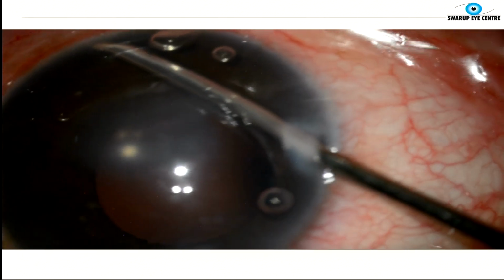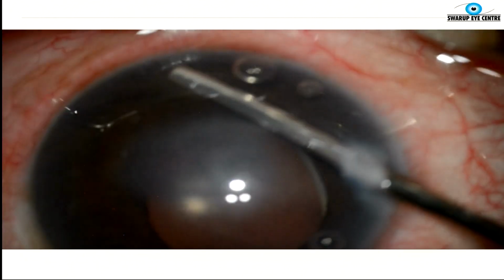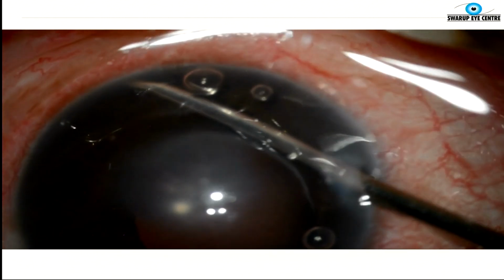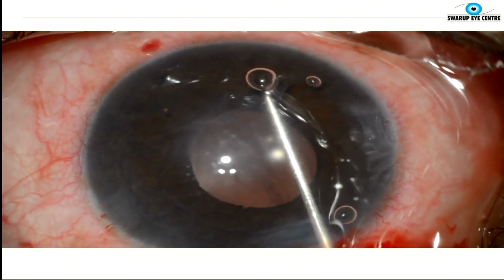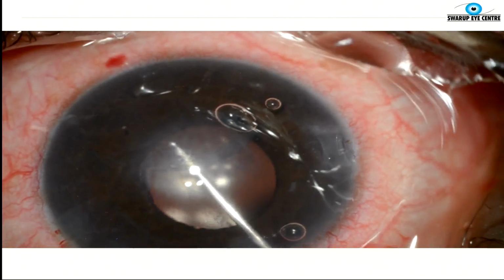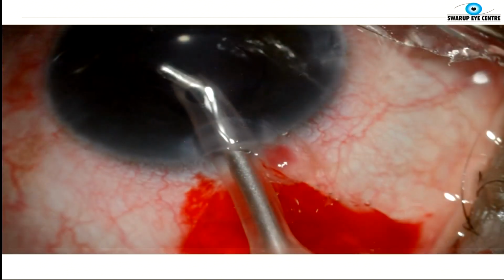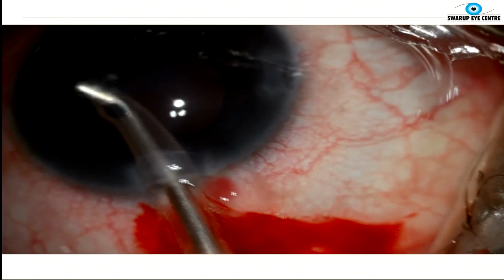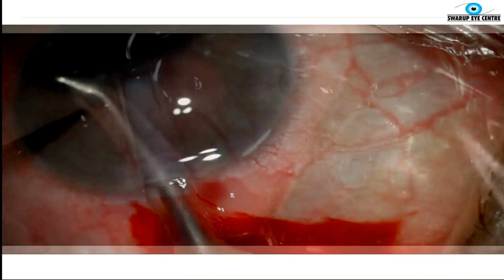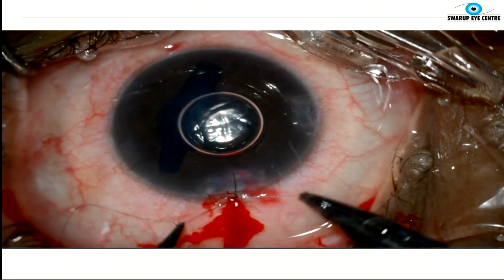It's a good idea to have an inferior PI. You can do a YAG peripheral iridotomy preoperatively or intraoperatively. You can create a small iridectomy. Then you strip the Descemet's membrane. You can do it under air or under a cohesive viscoelastic like so, just like we do for DSEK. It's a good idea to mark 8 mm on the anterior surface and then do this. And then aspirate the viscoelastic. You can do this surgery through a clear incision or a scleral tunnel, whatever you prefer. And then basically you have to shoot your graft in, I'm sorry.